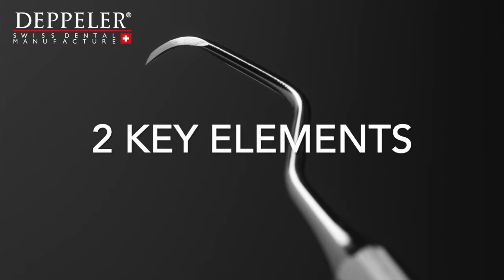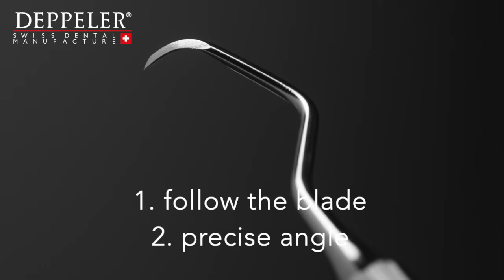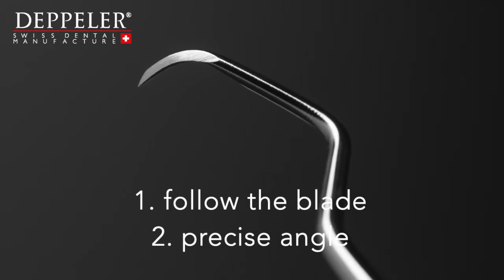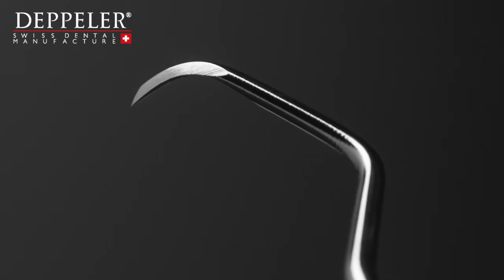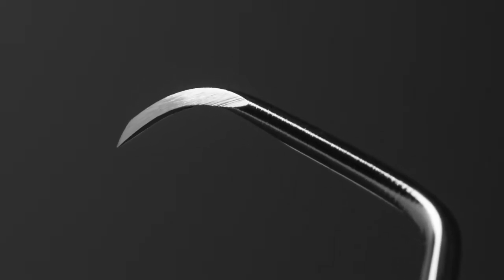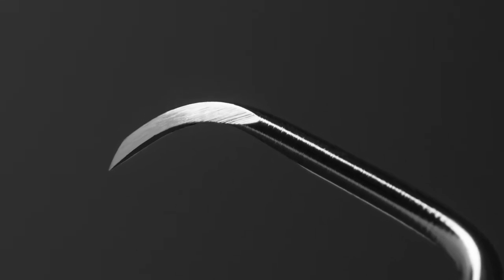The Deppler method relies on two key elements. One, the sharpening follows the structure of the steel and the curve of the blade. Two, maintaining a precise angle. Steel has a structure similar to that of wood. It is important to respect this structure and therefore sharpen by following it. You will then create a smoother surface and plane the blade's cutting edge. The cutting edge lasts longer thanks to this method.